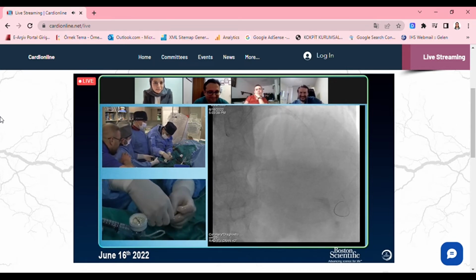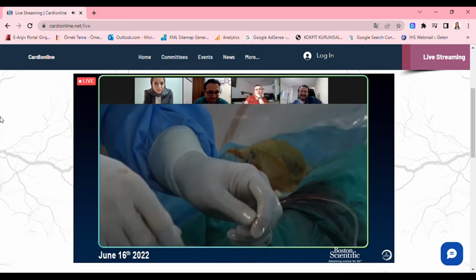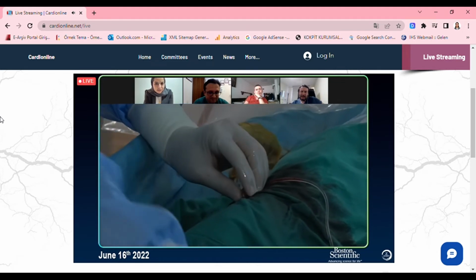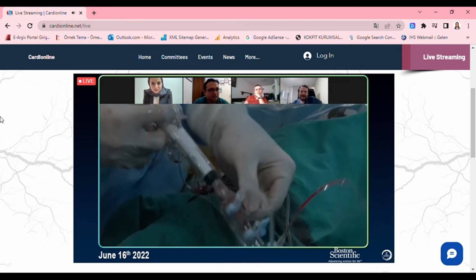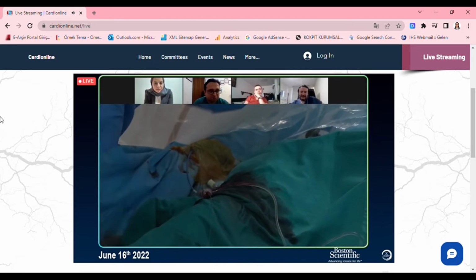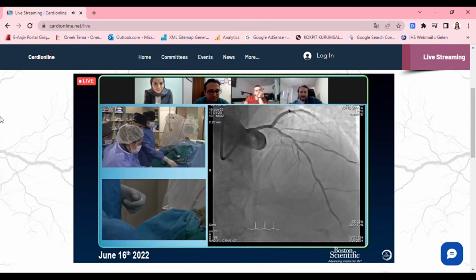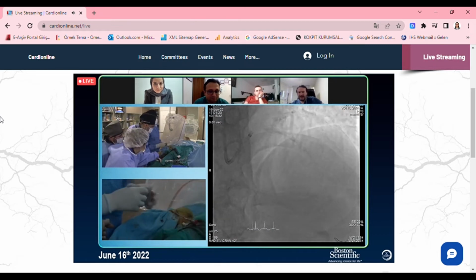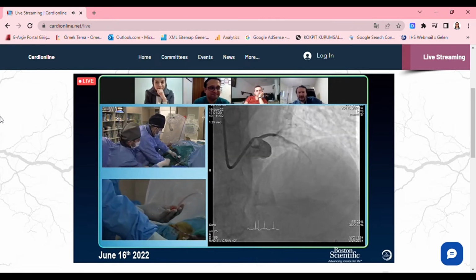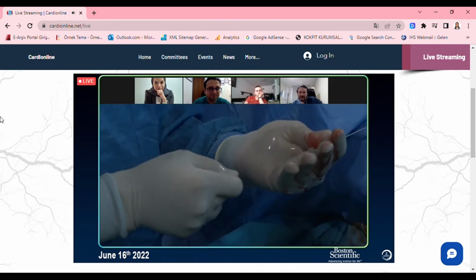Are you using an NC balloon? No, we are removing the Mamba catheter, and I would like to have another Choice wire for the side branch, and we will keep it open for the first diagonal too. How much is the ACT? It was 300. All right.